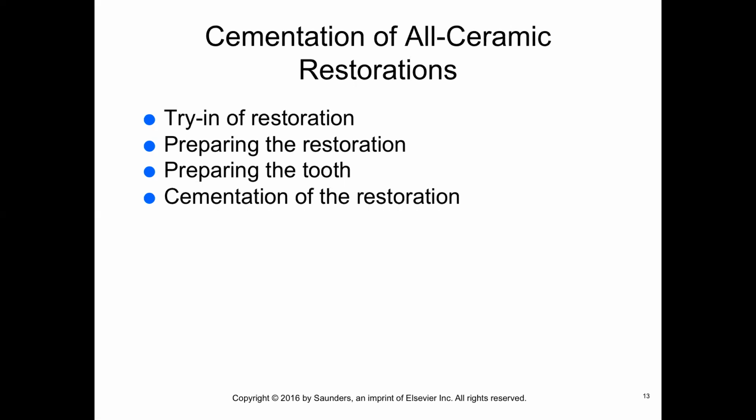Nowadays, they make a bonding liquid that is self-etching, so the need to use the acid etch when you're seating or delivering these crowns or bridges really is obsolete.